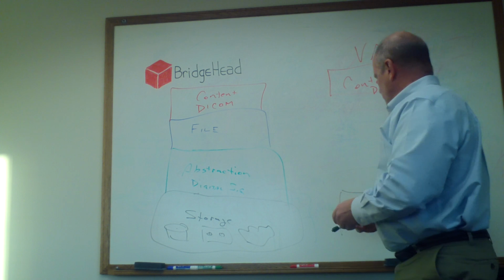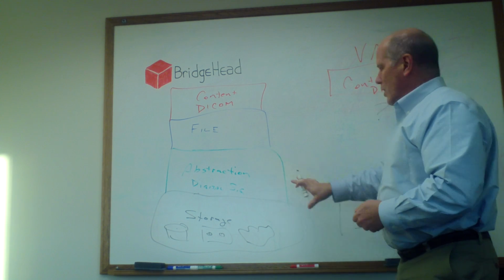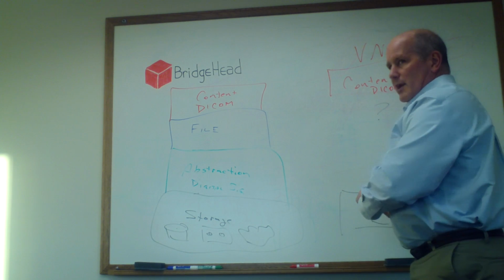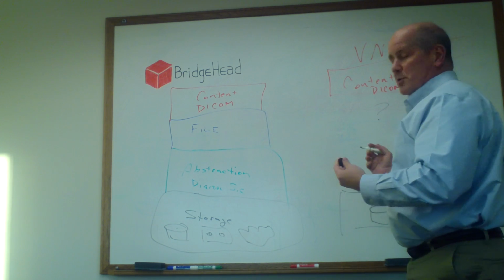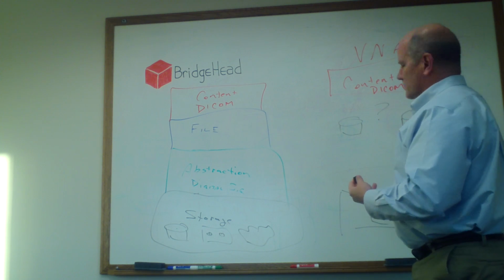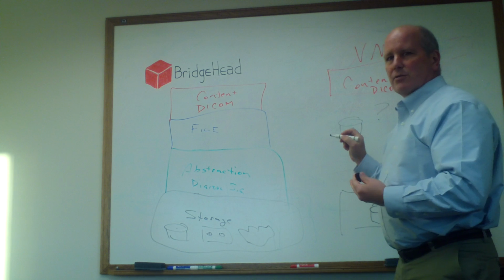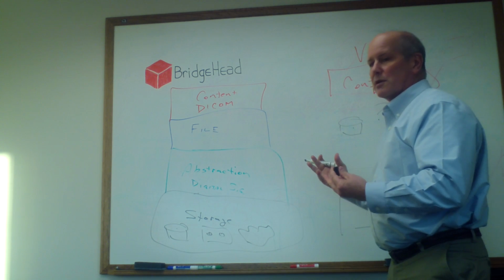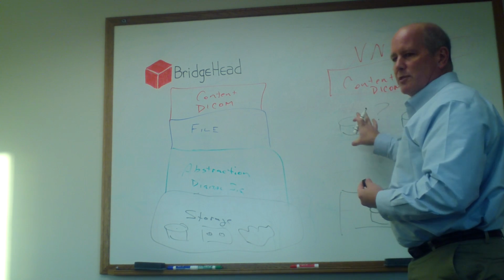The other part of the question is, where's the protection? Where are the layers that you get here? Where are things like digital signatures to make sure that the data you wrote is accurate and that what you're retrieving is accurate? VNA companies will say, well, if you want to protect the data, just have different sites and replicate the data across. The problem is, how are they detecting data corruption at these sites, and how are they correcting it when it does occur? Because it does occur on occasion. They don't have the methods built into these layers to be able to do that.